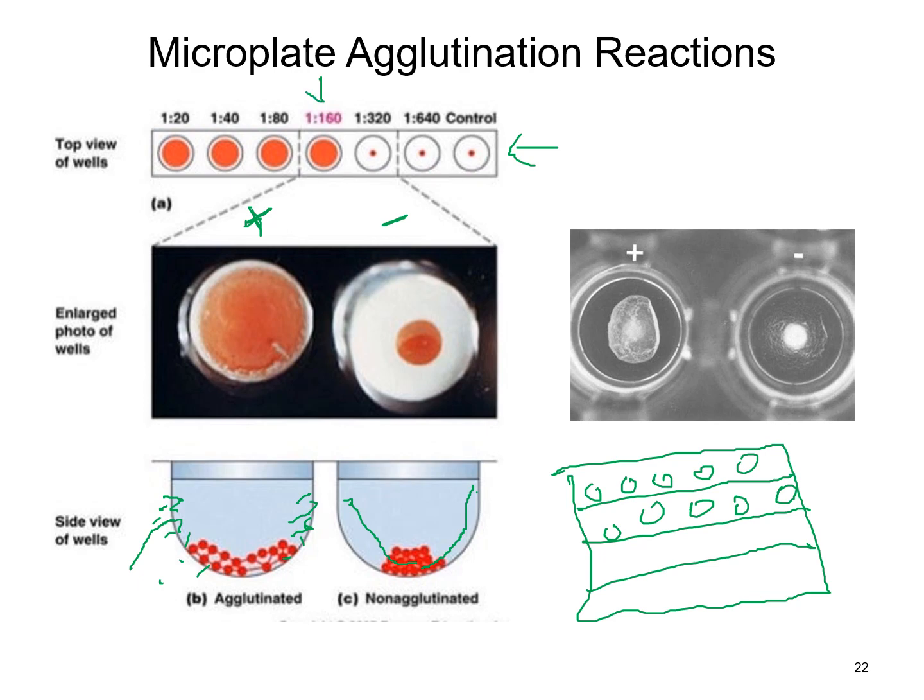So in this particular test here, they did a dilution of some sorts, and they had positive reactivity all the way up to the 1 to 160. So everything after this is all considered negative. This is all positive. So the last result of the positive is the part that we would actually report out.